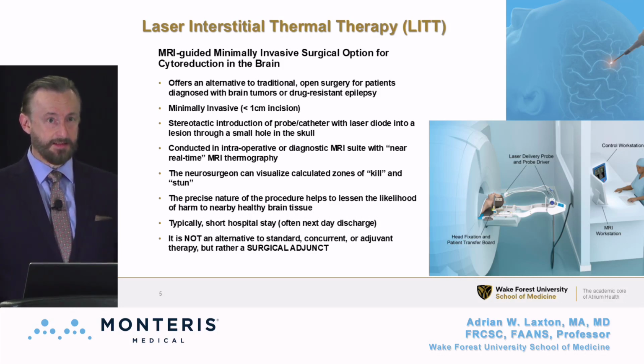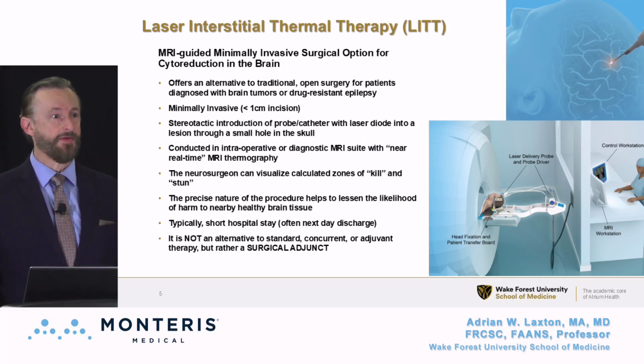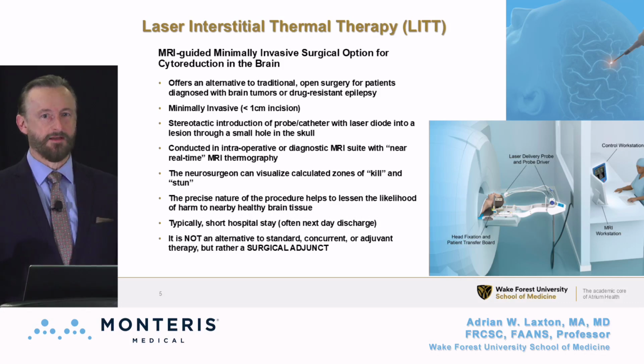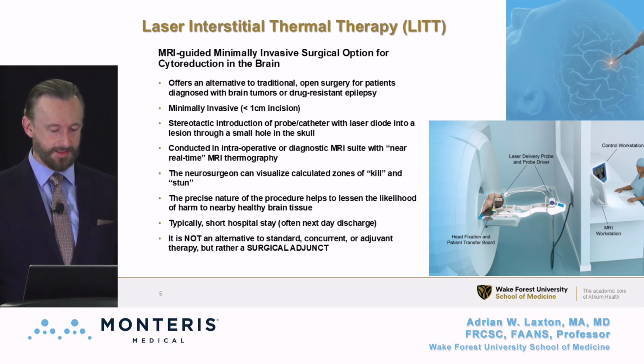It is conducted in an MRI, right? So that's the essential advance. We've made lesions in the brain since the late 1940s, but really the advance here is the bringing together of advanced computing, advanced MR, and advances in MR thermometry. So we can see what we're doing with MR, but we can also measure the temperature. So it's real-time monitoring, which adds a level of precision and safety that I think is a huge game changer and really is what makes LITT so exciting. We can visualize exactly what we're doing and thus ideally prevent any unwanted effects.